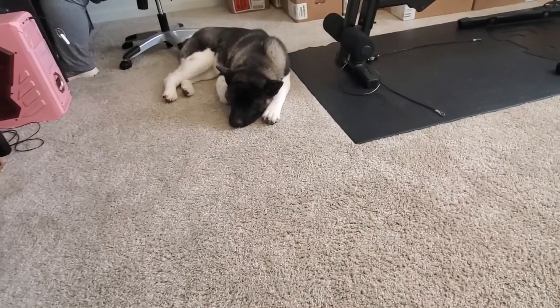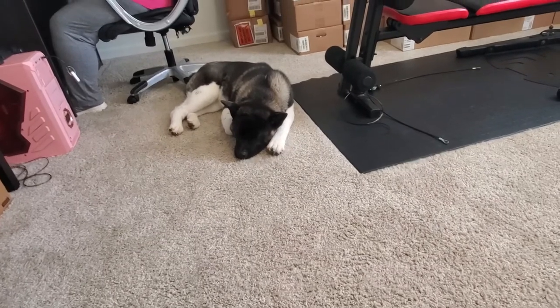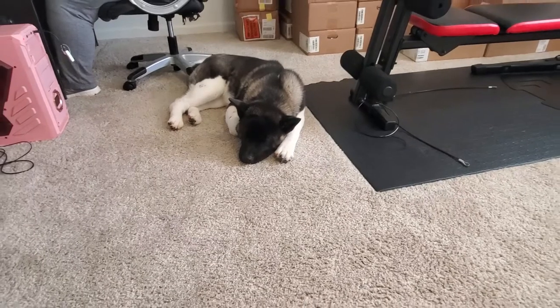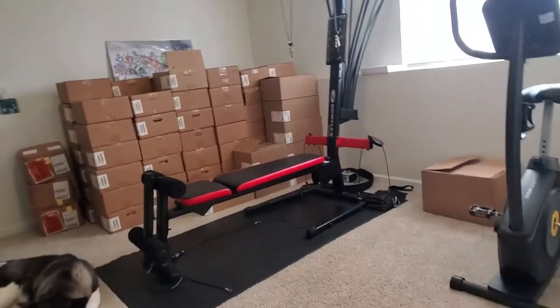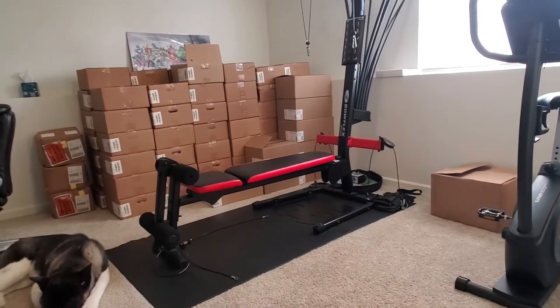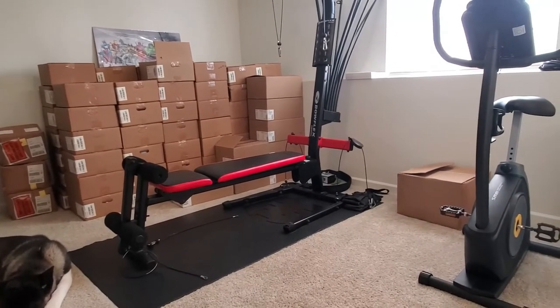Tell everybody hello! But I just want you to see the order — that's a lot of stuff. I'm getting another machine, so I wanted to get all these boxes.